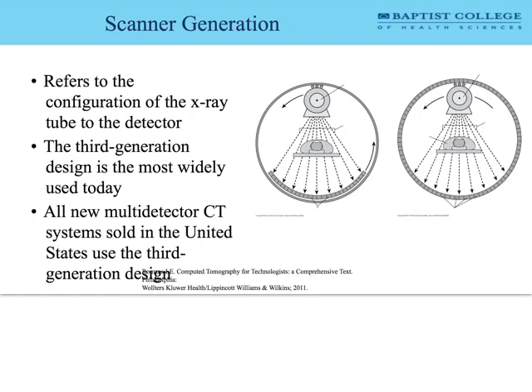It used a single beam of X-rays, almost like a pencil beam of X-ray, and a single detector. And they scanned across the patient, and then they reset, and they moved, and they scanned, and they reset. And you can imagine that took a long time, like upwards of 20 minutes to get a single slice. A long time. So 2nd generation was awesome in that it introduced a fan beam way of scanning.